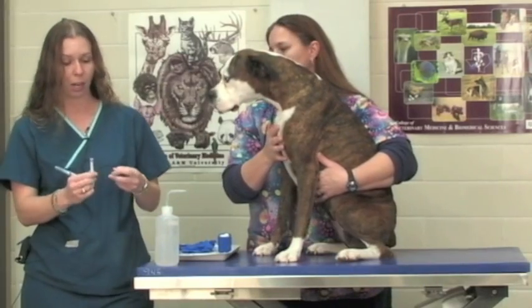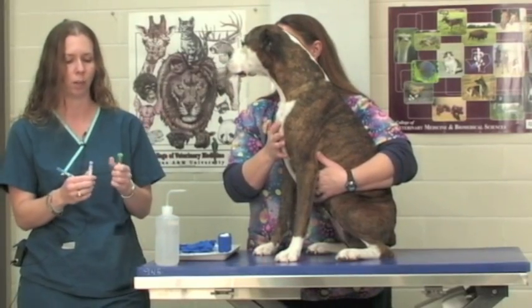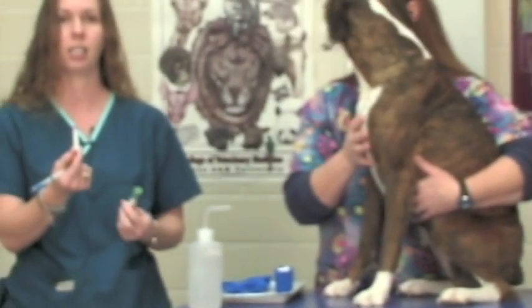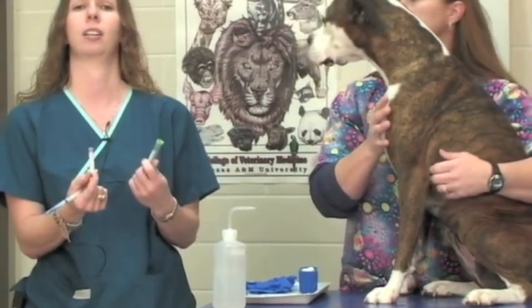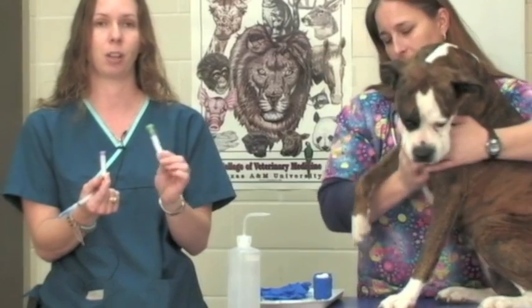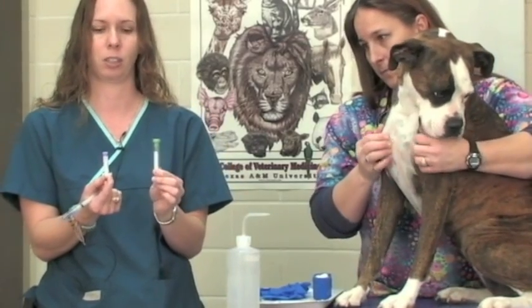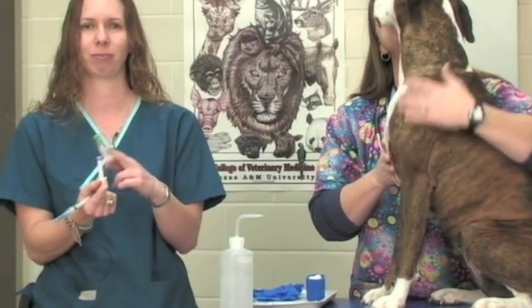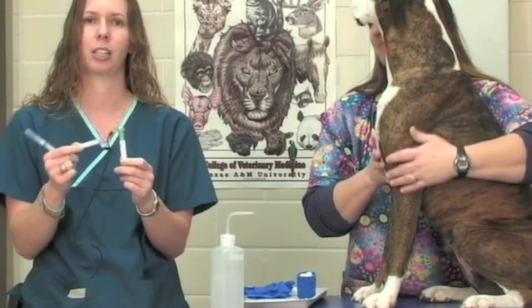We do have several tube types that we put blood into and they have different additives in them. This purple top has EDTA in it, which is the anticoagulant used in it, and this green top tube has lithium heparin in it — another type of tube that we use here at the vet school. We typically put our CBCs or complete blood panels in a purple top and we generally put our chemistry panels in a green top tube.